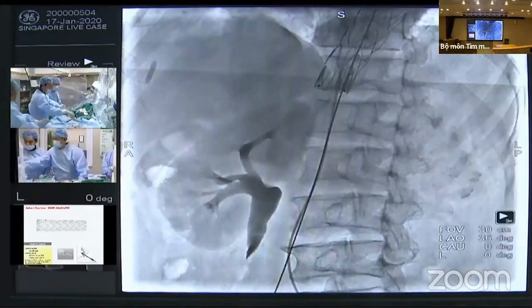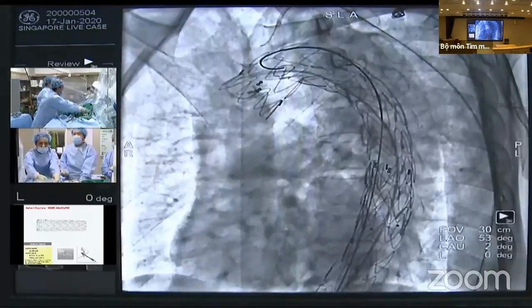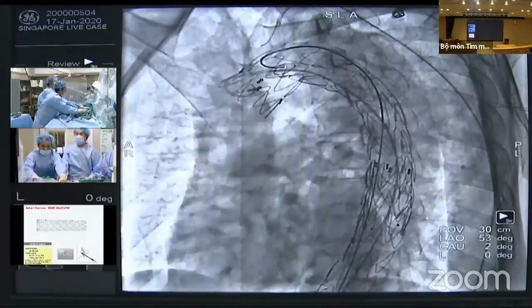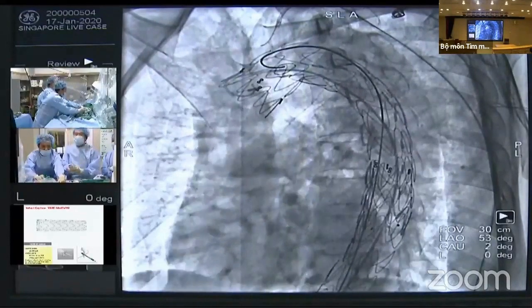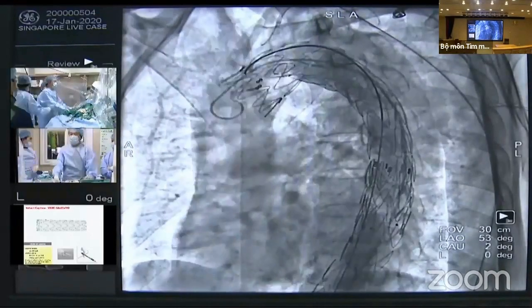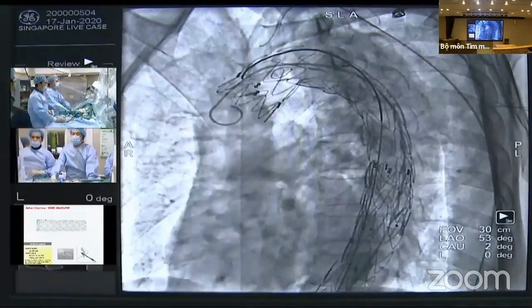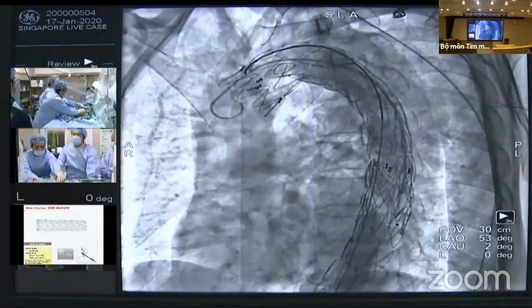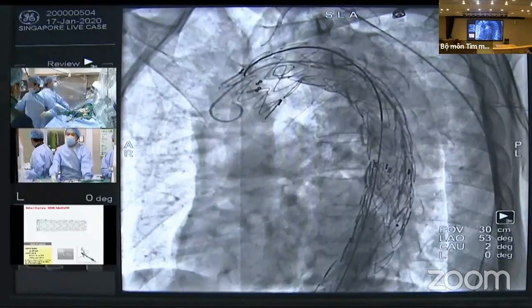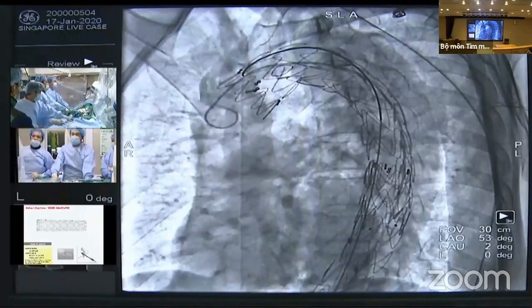Okay. So what do you do now, Professor Hung? How about the distal part of the stent? Actually, we already deployed the second stent, and here you can see the picture. Yeah, this is the proximal part of the stent. You can see the root cover just right up to the left carotid, and no endoleak was found, but I think this position is okay. So actually we turned from plan A to plan B because the penetration in this case is not as acute as we expected before.